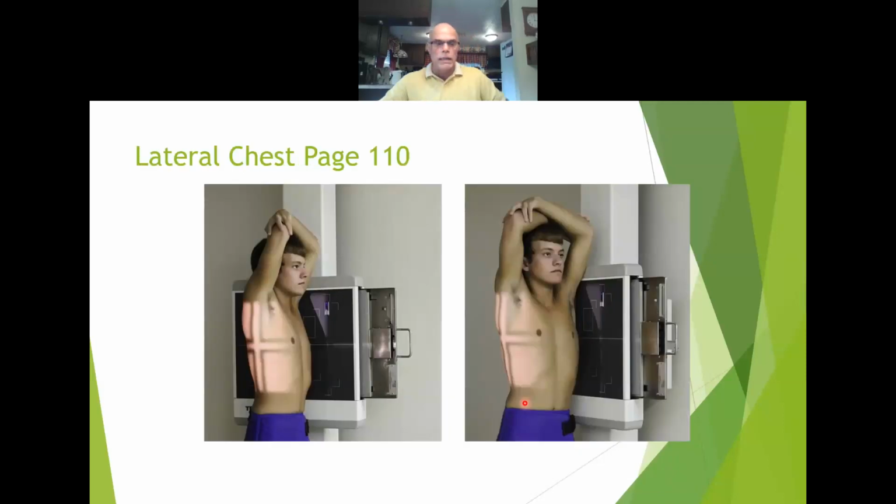This is on page 110. Lateral projection, positioned by manufacturer or department protocol for proper anatomy display orientation. CR plate 14 by 17. If you're still doing CR, it's going to be the same thing as we talked about with the PA. Same thing with the minimum distance.